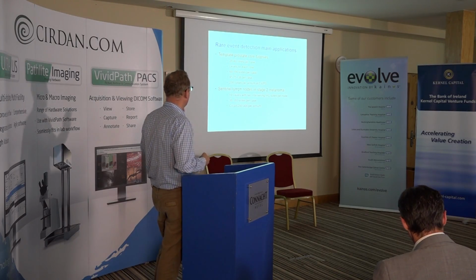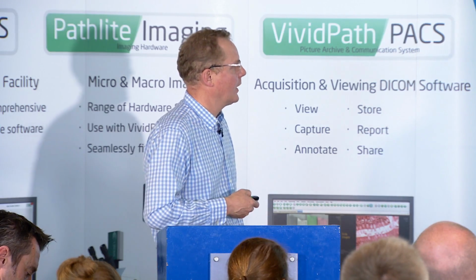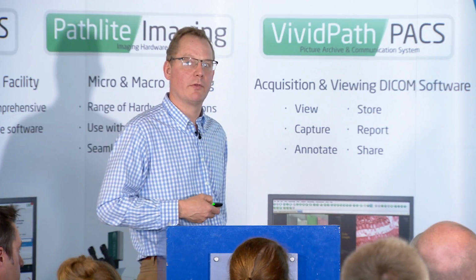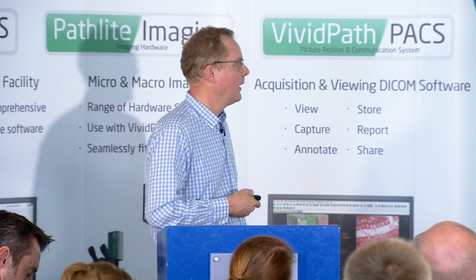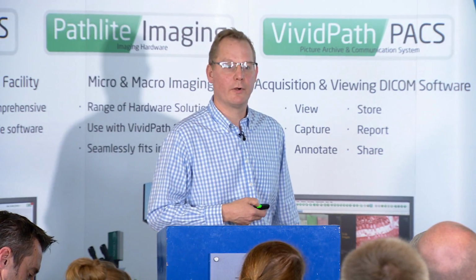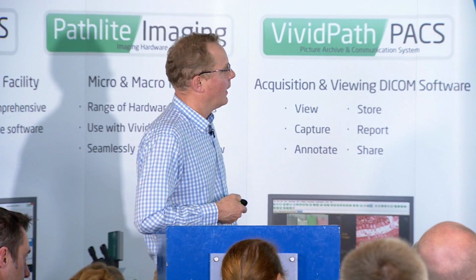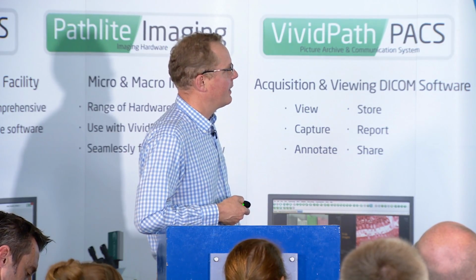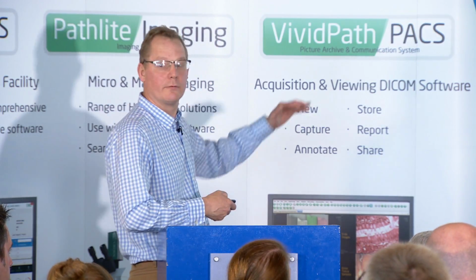And when you're into that level of tissue examination, fatigue starts to creep in at the pathologist level. You have a real problem in maintaining quality of what becomes a very laborious and boring process of looking for rare events in lots of slides. And this is big data. We're generating 45, 75 gigabytes per case in this instance.